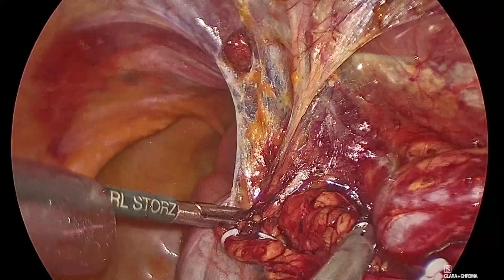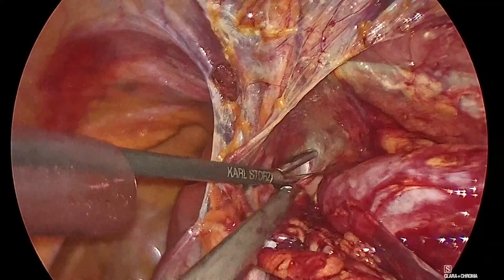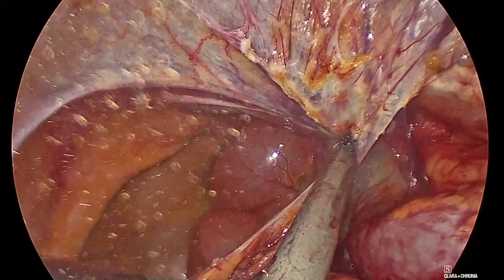So I don't think we need to do much more here because we have already dissected everything, the kidney is already dissected, and here is where now the open part will take place. We can struggle a little bit more in here if we want to, but it's not really going to help us any more, because really we are down there. So now it's just a matter of 20 minutes. We open.